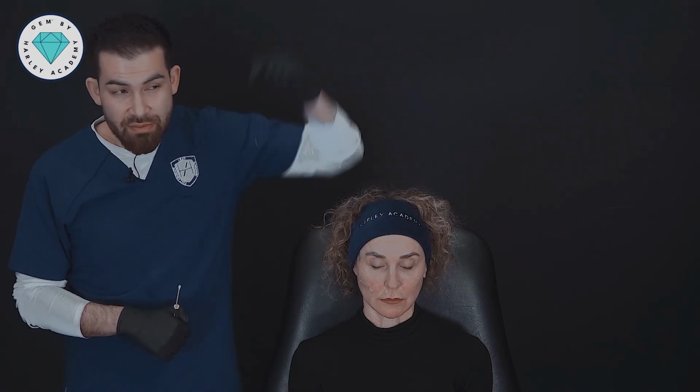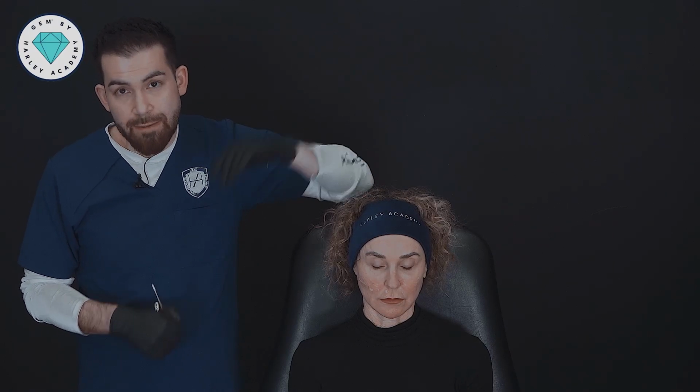There is very little filler deep down onto bone, which means that if we try to dissolve that filler with a hyaluronidase deep down onto bone, we may actually miss it. The best way to treat and dissolve this unwanted filler in the midface is actually with a cannula. And so we're gonna do that. The specific anatomy of the compartments that we want to treat with retreat, we will cover in the next session. But for today, let's get on with dissolving some of that filler.